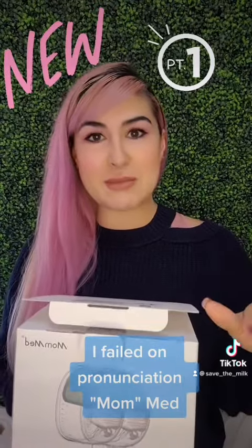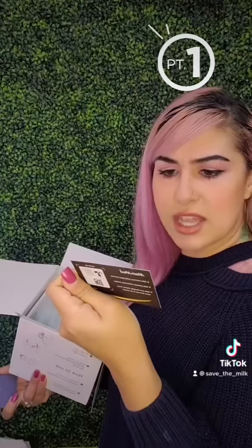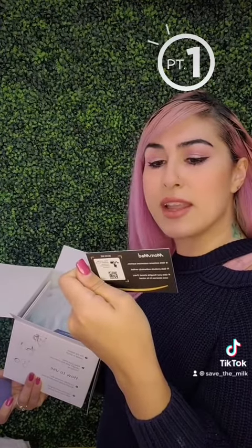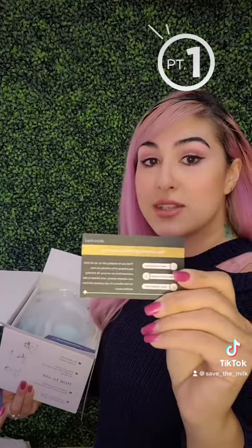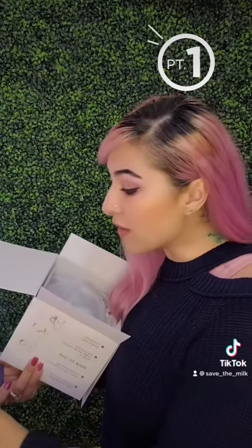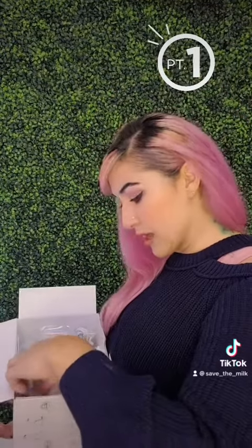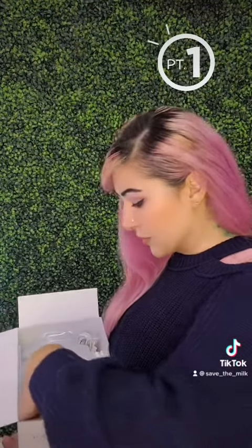Let's start with seeing what's inside. It looks like you can get a lifetime warranty — yeah, lifetime warranty on these mobile pumps. You really don't get that with any other pump. You can see here: 'activate your lifetime warranty.' I totally love this, this is cute.